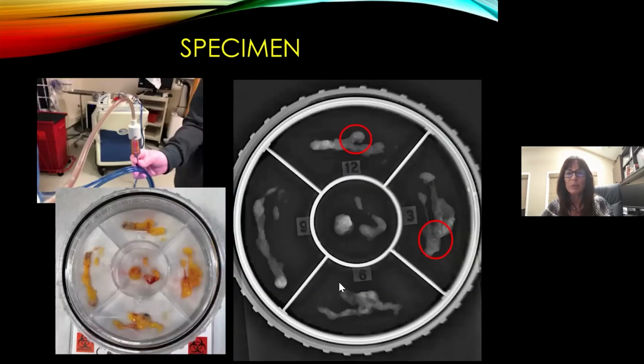We would obtain a specimen radiograph. Here are the specimens arrayed in a core biopsy specimen container. And this is the radiograph of those same samples. The reason we do this specifically in this core container is that our pathologists like to have our specimens separated between those that have calcifications and those that do not. They do look at everything, but they like to do their own RAD-path correlation and make sure they know that they are looking at the target calcifications. Over here in the top left is just what these specimens look like in the container that's attached to the needle.